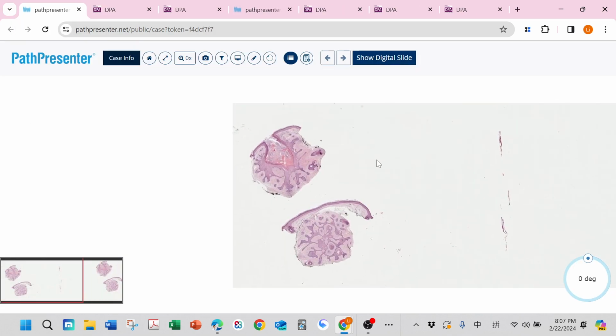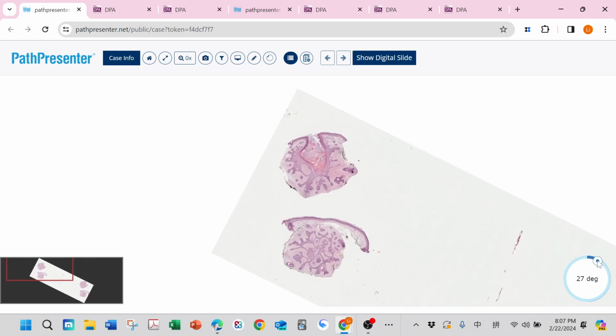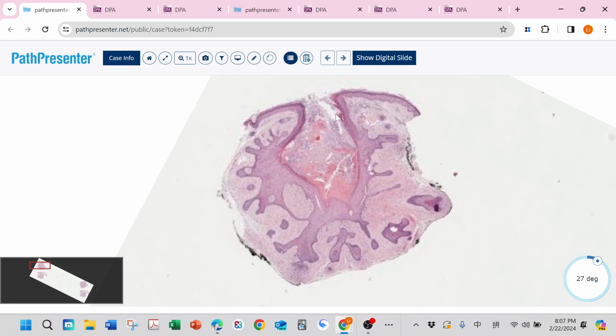And then I put this entity together for this one, kind of similar. We also see in low power this dilated hair follicle, but outside you do not see that baby follicle. All the outside is just like some stretched out epidermis or maybe hair follicle component, but you do not really see the baby hair follicle.